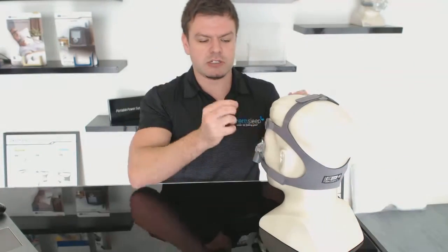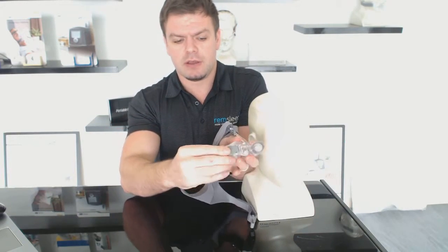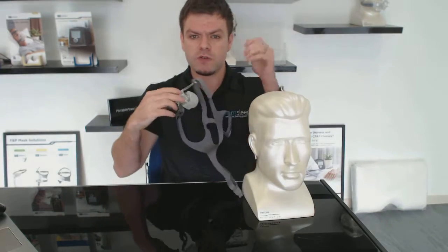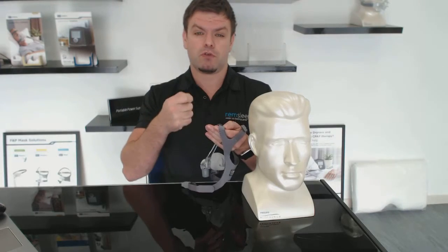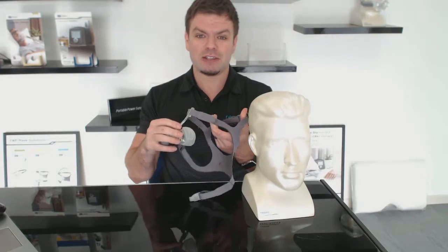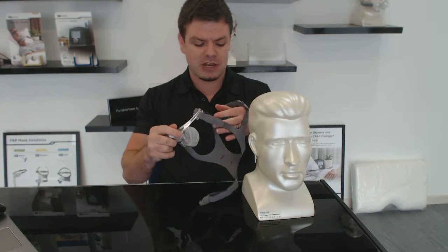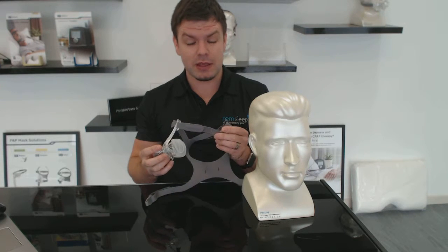A tip when using this mask: don't constantly be adjusting the velcro back and forth. When you take it off, always use the clips on the side — they're solid clips and they don't break. Get into the habit of putting it on with the clip and taking it off with the clip. Once you've got the fit right you shouldn't really need to adjust the velcro all the time. With all velcro on all masks, eventually the velcro stops gripping, so if you just use the clips your headgear is going to last a long time and you'll need to replace fewer parts.